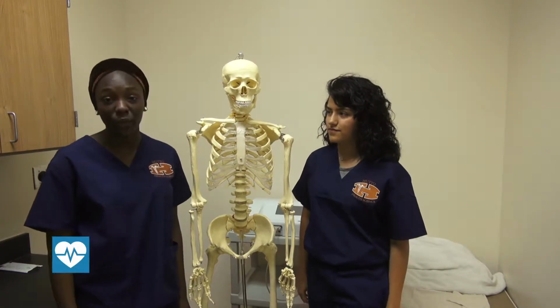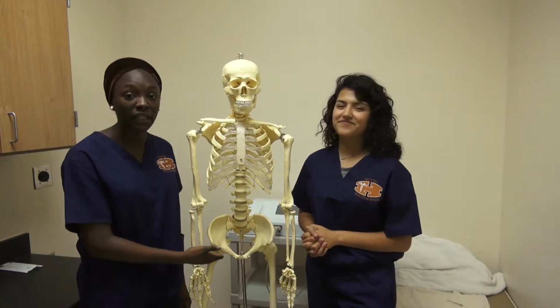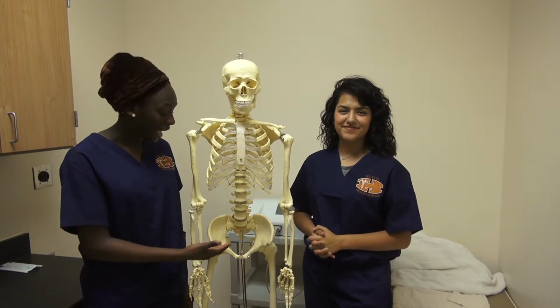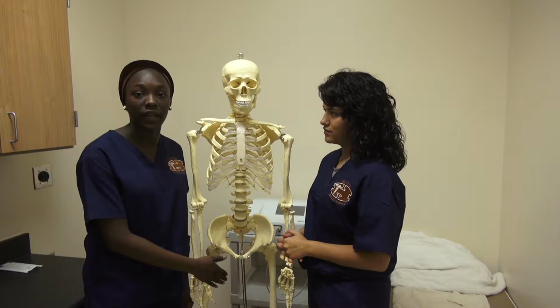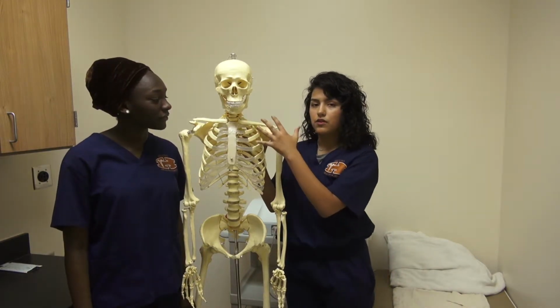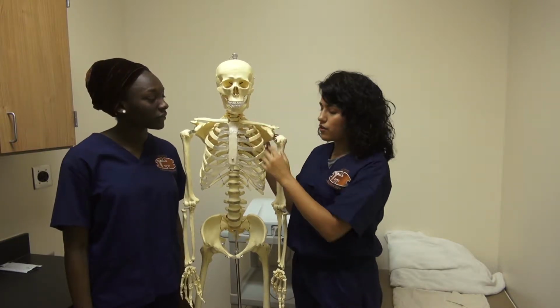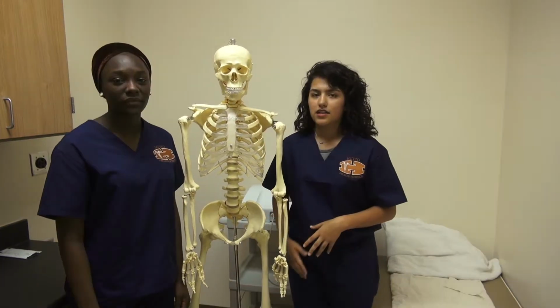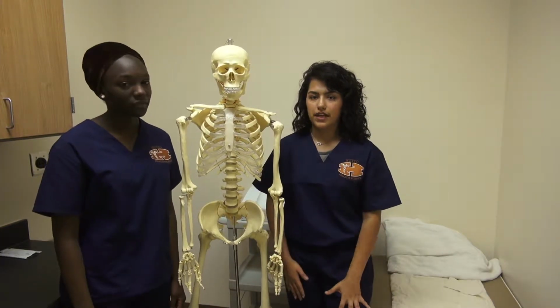Okay, so to begin with, we're going to talk about the white limb lead, which can be placed in the right shoulder area or the right arm. And then below that, we have the green lead, which just serves as the ground lead, and it's placed in the right lower abdominal area or the right leg. So the next lead that you would place is a black lead, and it goes on the left side, and you would place it on the shoulder area or in the inside of the arm. And the red lead would go in the abdominal area or in the left leg.